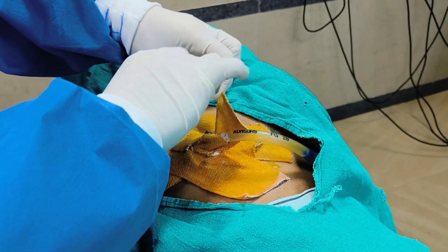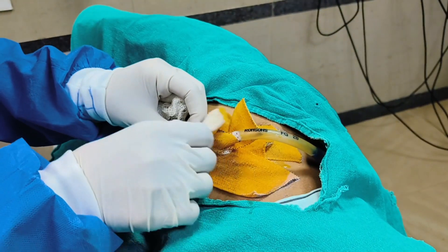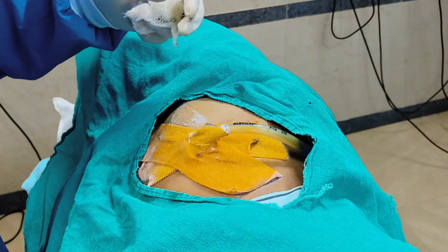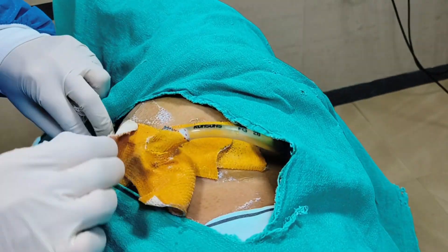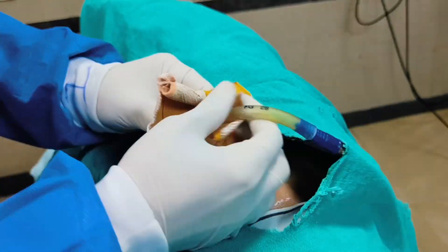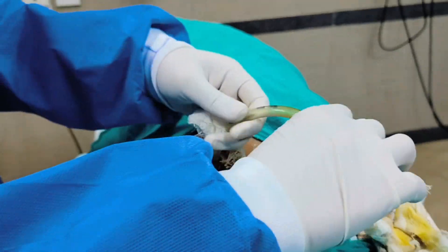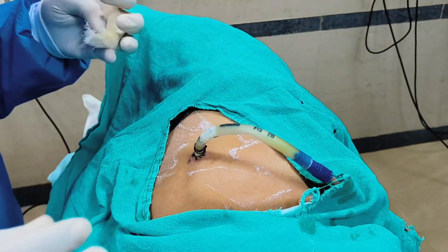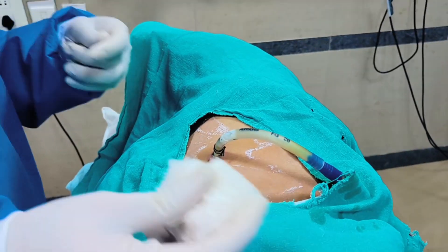We can remove one by one, layer by layer, or we can remove as a whole by disconnecting the chest tube. In this case we will remove as a whole. Now we will disconnect the chest tube and remove it. After that we will change our gloves to maintain sterility.